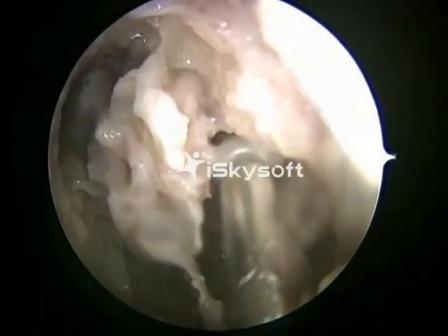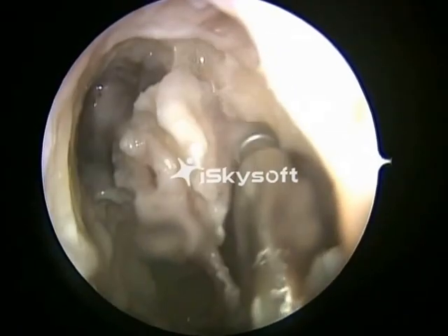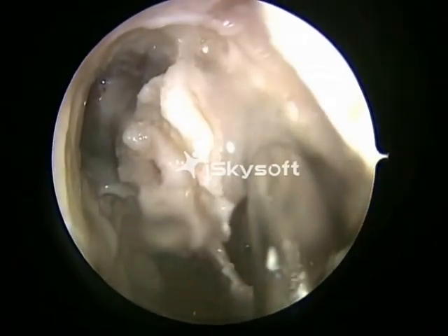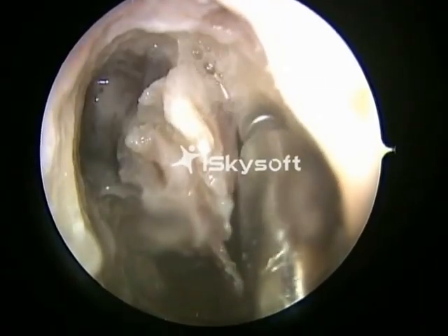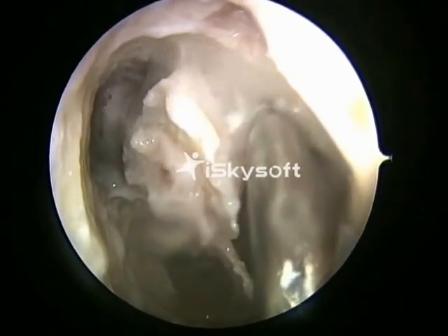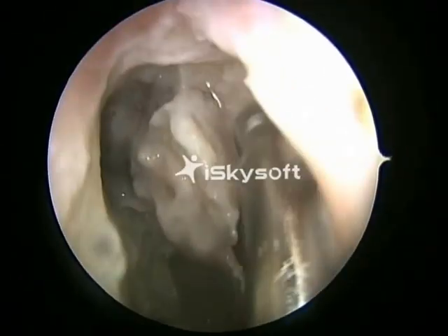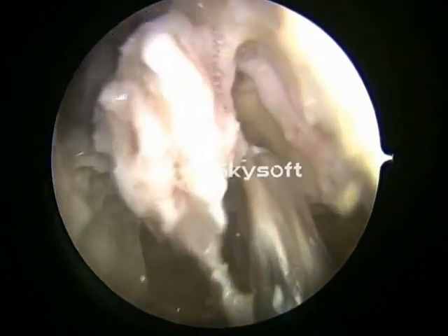The same steps are repeated on the left side. Note that the drill is being used from the right nostril, and the dissection is being done on the left side.